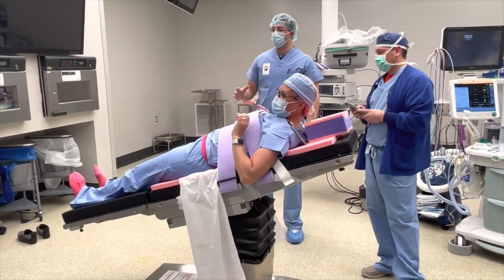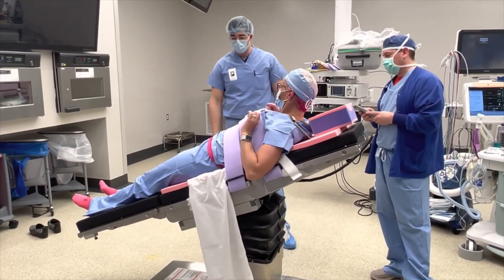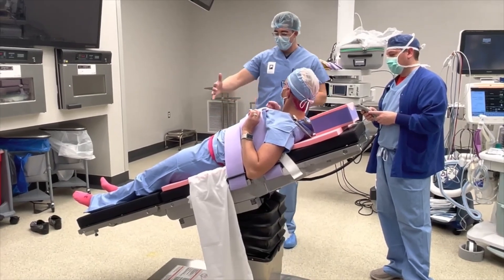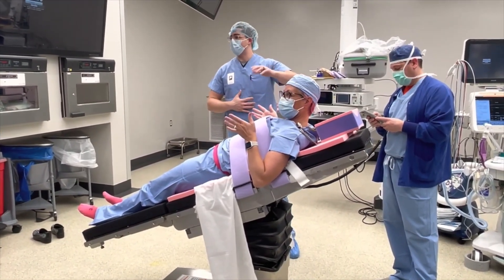We had a 9-hour case at the Chicago facility. I wasn't there for this case, but we did have a 9-hour complication where we just put two pink pads next to each other. They did have to prepare for surgery.